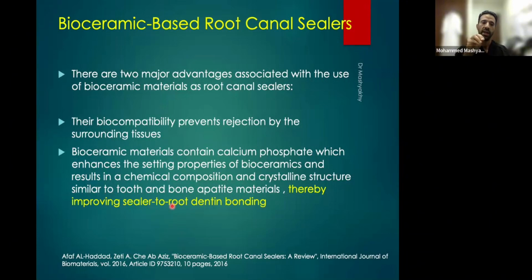When you're pushing the gutta percha cone through the sealer injected inside the root canal system, it will push the sealer into the irregularities, lateral canals, and isthmuses, so it can fit and it doesn't shrink. It's stable. So that's what they claim, and there is a very good outcome.